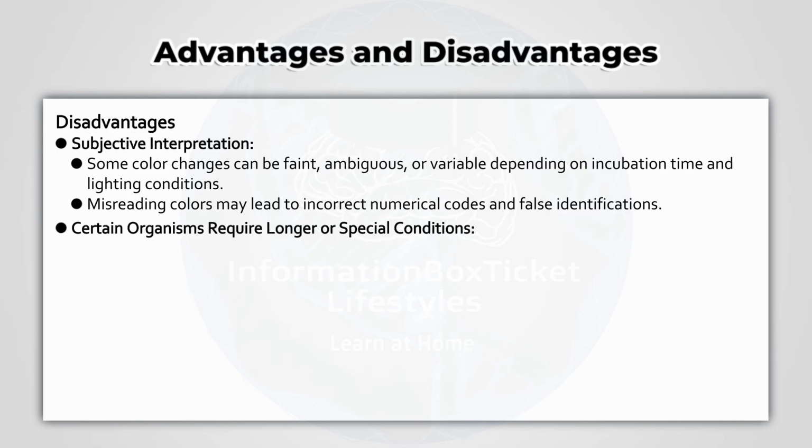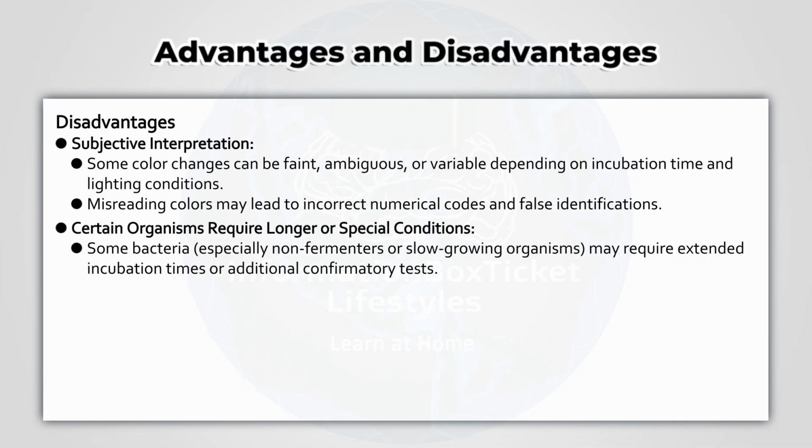Certain organisms require longer or special conditions. Some bacteria, especially non-fermenters or slow-growing organisms, may require extended incubation times or additional confirmatory tests.